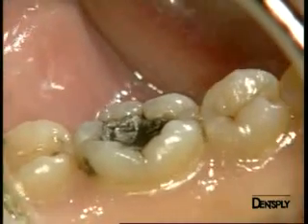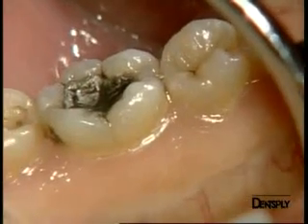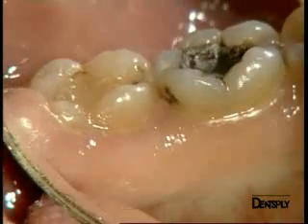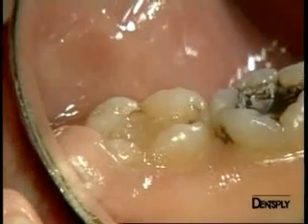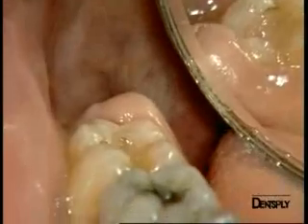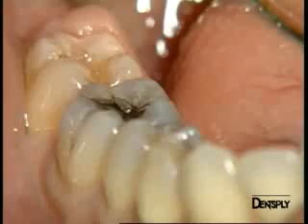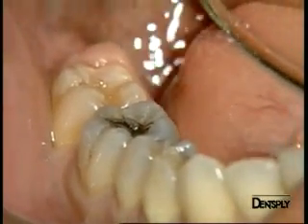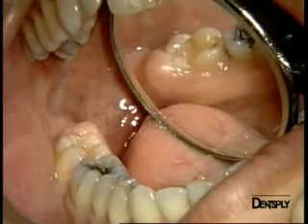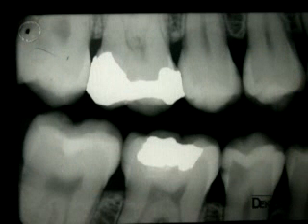This patient exhibits active caries and has several fillings, as well as a primary caries lesion on tooth 5 in the lower jaw. The old amalgam in tooth 6 is also defective, and the composite in tooth 7 is unsatisfactory — therefore both will need replacements. We can see an occlusal view of the different fillings with, in particular, the discoloration caused by the corrosion of the amalgam. The X-ray shows a large distal caries decay on the premolar.